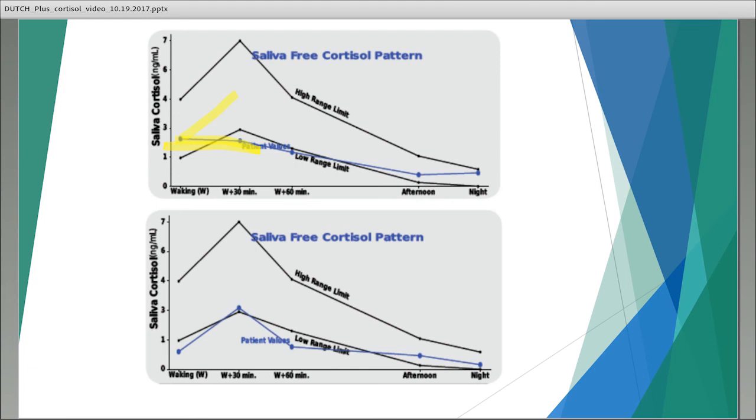It's also getting a little bit higher than it should be at bedtime, so there's really a very dysfunctional diurnal pattern of cortisol and it's very low, right? On the second example, yes, it's relatively low. We're low here, we're low here, we're creeping into the range here, and then in the afternoon it looks okay. But you've got relatively low levels of free cortisol, but what the cortisol awakening response adds into the picture is that all is not lost here, right?